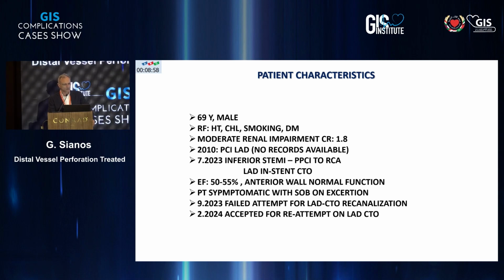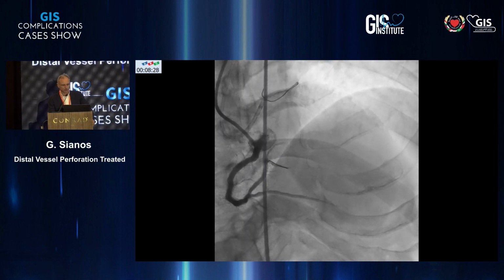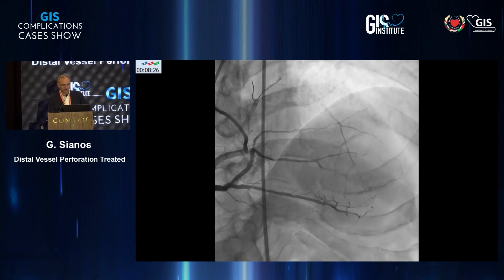The patient was not very symptomatic, but he had some shortness of breath on exertion. He was also very keen, because patients sometimes push their luck, and you will see why, to have this vessel open. He was an elegant man, and in September of 2023 there was a failure of recanalizing his LAD. Then he was referred to us, and we decided to take over the case. I will not present the initial procedures, just what we did.